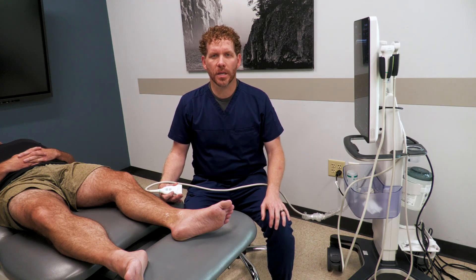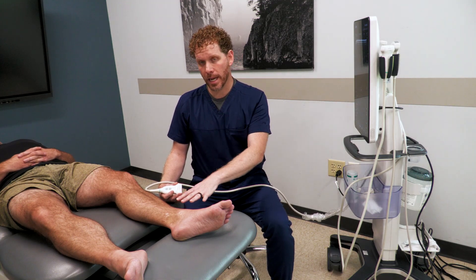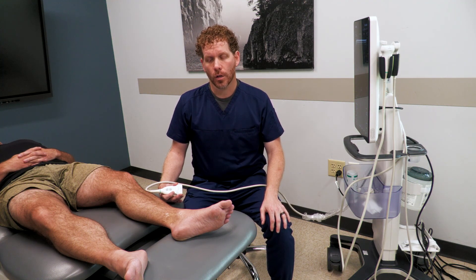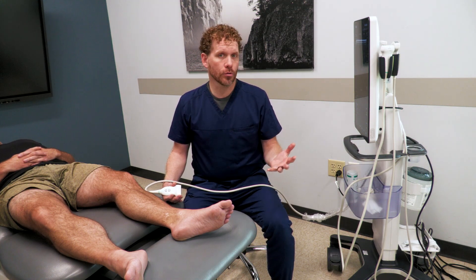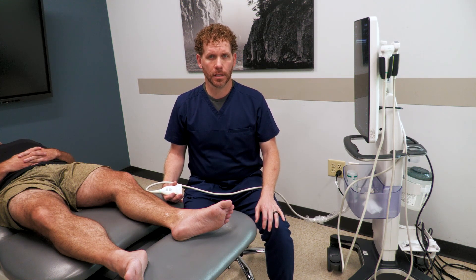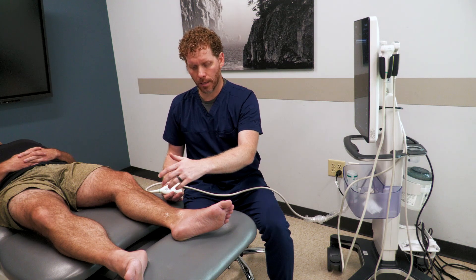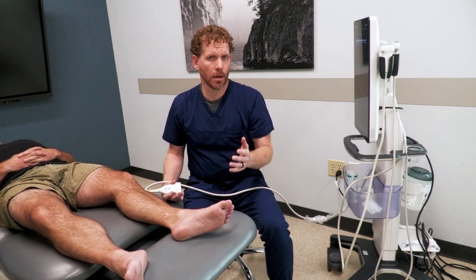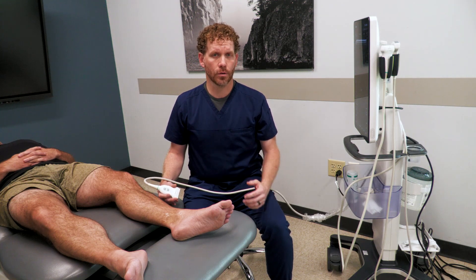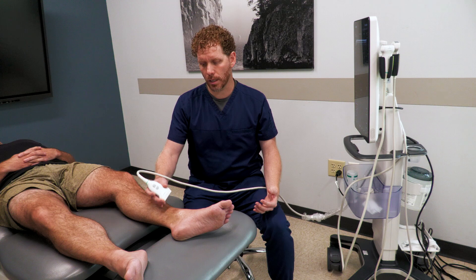Hey, this is Dr. Eric Phillippe with RPI. I just wanted to give you a quick tip on the medial ankle, specifically related to the tibial nerve. I want to show you an ultrasound of the region just posterior to the medial malleolus, in between the Achilles tendon and the medial malleolus. This quick tip is going to show you image optimization and a few other techniques with ultrasound to make sure that we are doing a safe injection and also getting good imaging of that nerve.